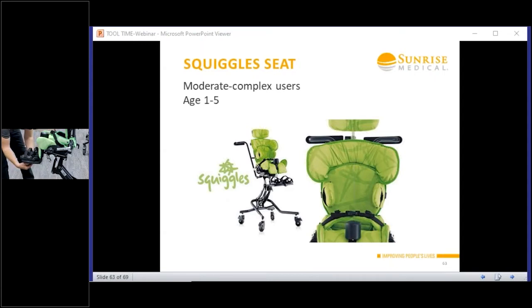And then you've got your foot sandal. It's going to give you, kind of like this is your hanger, you know, on your wheelchairs we're thinking about 70° and that sort of thing. We can change that just by the different ankle huggers on here.